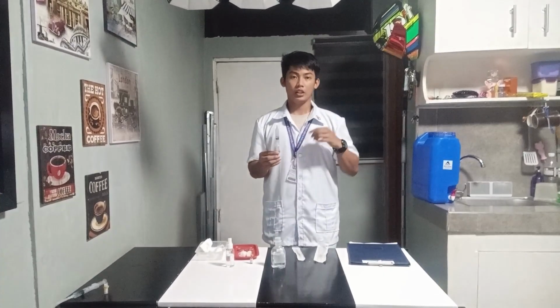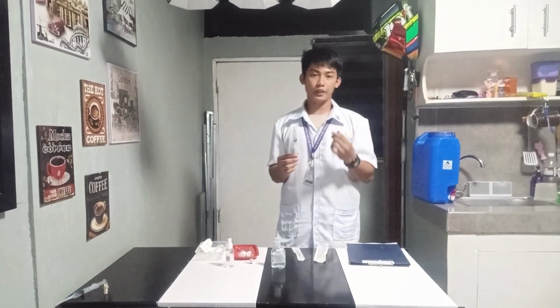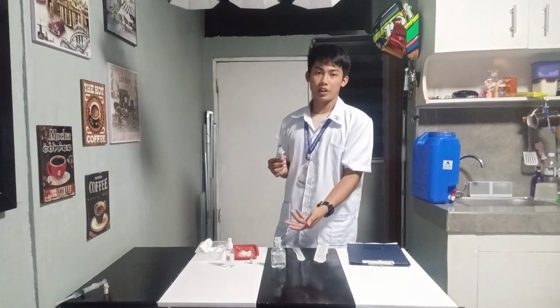Then inject the air into the vial, keeping the bevel of the needle above the surface of the medication. Again, the air is helpful in order to easily withdraw the medication. Now gradually withdraw the prescribed amount of the medication by holding the vial down.